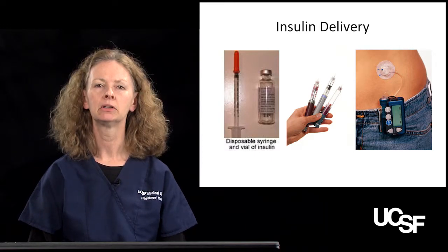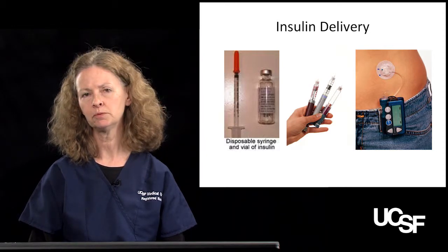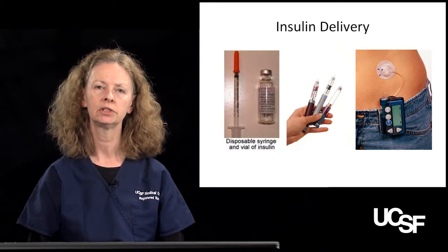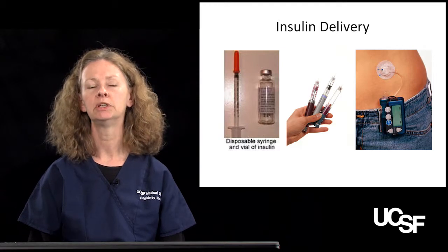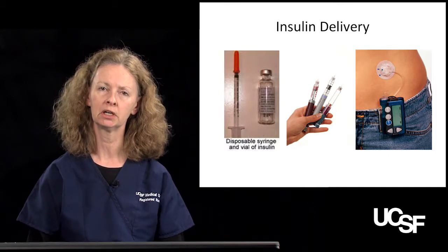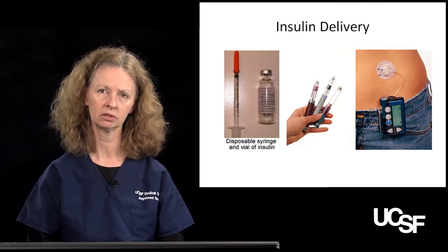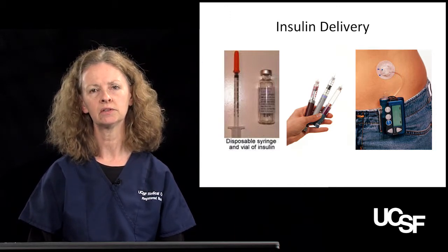So next we're going to talk about insulin pump therapy. Insulin pump therapy does provide some advantages. The insulin pump really is just a reservoir of insulin that is driven by a pump into an infusion set and is controlled by the patient. So the insulin pump will deliver a basal insulin, and this can be set very precisely to accommodate the patient's diurnal patterns and insulin needs, much better than we can do with injected insulin.